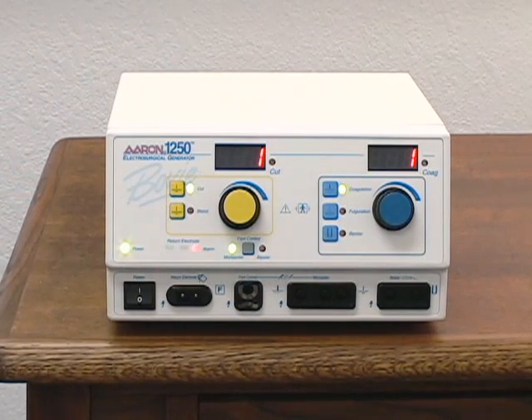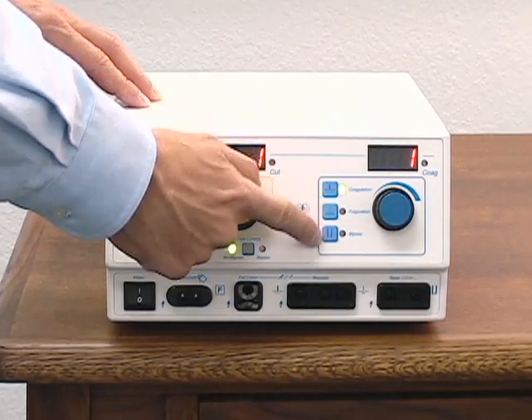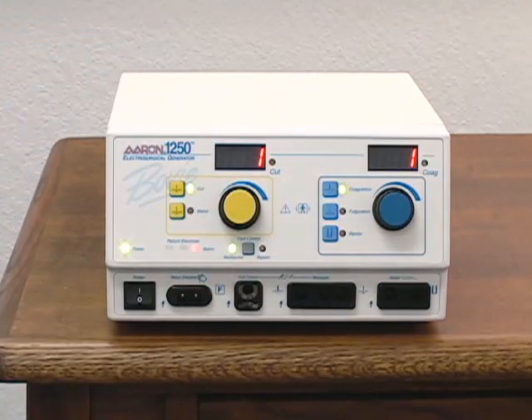The Aaron 1250 has five operating modes: cut, blend, coagulation, fulguration, and bipolar. To select an operating mode, simply press the button indicating the desired mode.